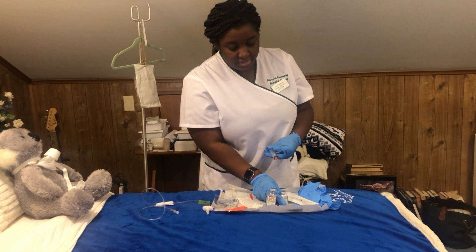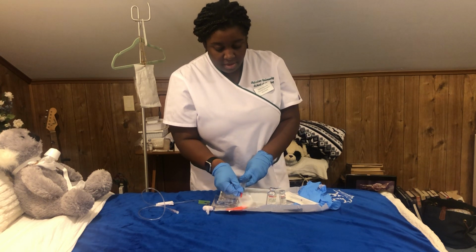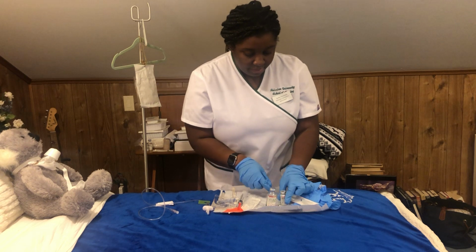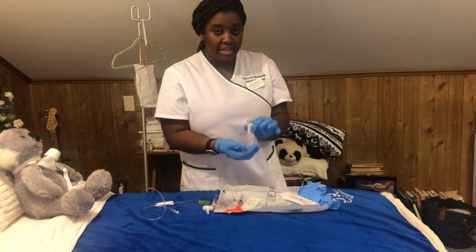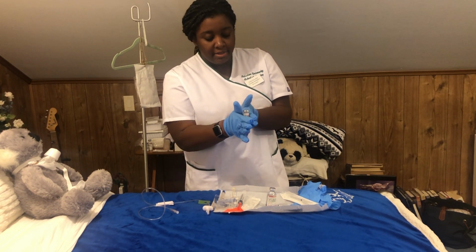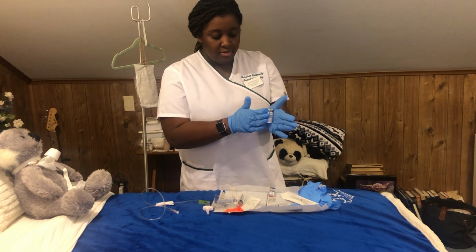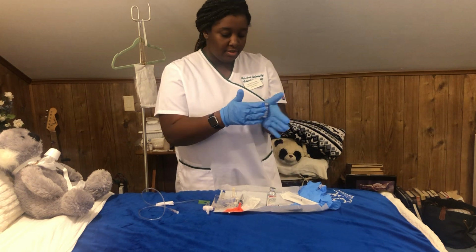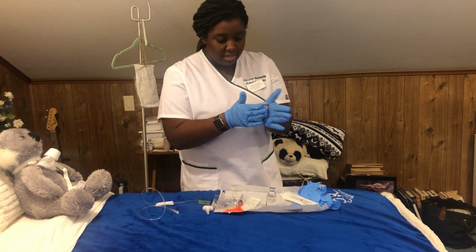Okay, I'm just gonna rest this one down for a little bit. I am uncapping and putting my first syringe into the sharps container. Now with this medication, because it's a powder reconstitution, I cannot shake vigorously, so I will just palm roll until the medication is even. Okay, so just a few more seconds. It's looking good. Everything is dissolving, diluting.